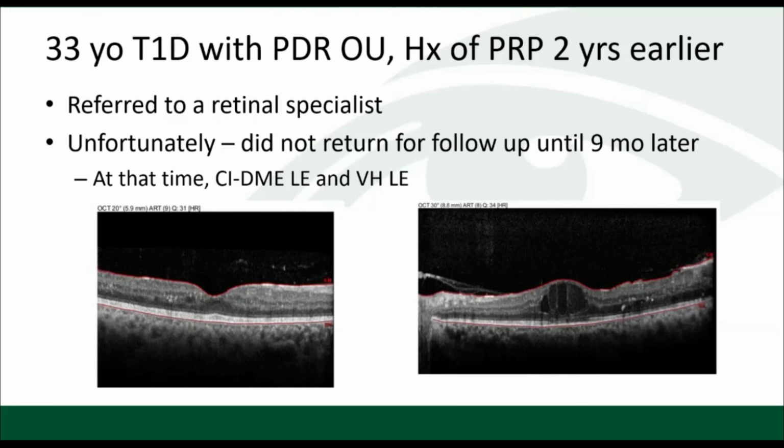They might have kidney disease, all those things that we think about when we schedule somebody to get fluorescein angiography. And with fluorescein angiography, we do look at that leakage, but as we're studying more and more the biomarkers, how they appear on OCT-A, that might change the way we manage these patients.